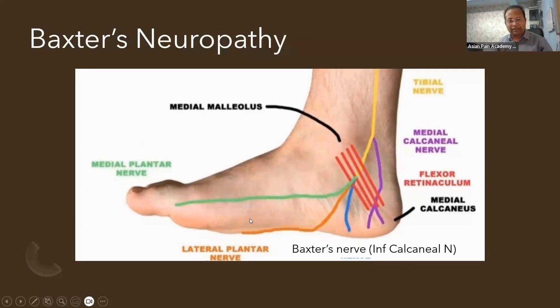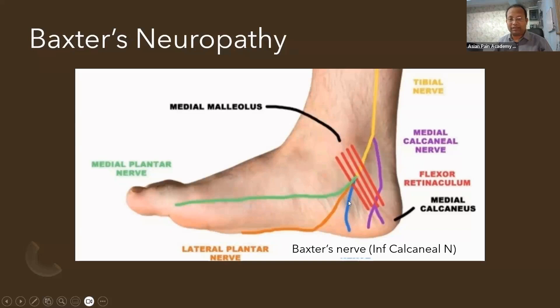Now, what is Baxter's neuropathy? It is the entrapment of the first branch of the lateral plantar nerve. Here we can see the posterior tibial nerve dividing into the medial plantar nerve, lateral plantar nerve, and the first branch of the lateral plantar nerve — this is called the Baxter's nerve. A high-frequency linear probe is needed to locate it, as it can be entrapped in this area.